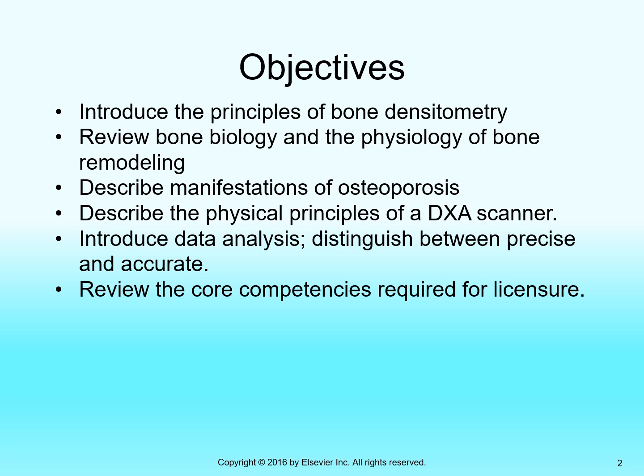So we're going to talk about what is bone densitometry. It is a specialization, very much like CT, MRI, nuclear medicine, so it's a modality. It's got a very limited scope as far as the exam itself, but the exam is technical and does require special application of physics. Low energy beam absorption or attenuation versus high energy beam absorption and the differential between those. And understanding that lends itself to the understanding of what we're really doing with a bone densitometry machine.